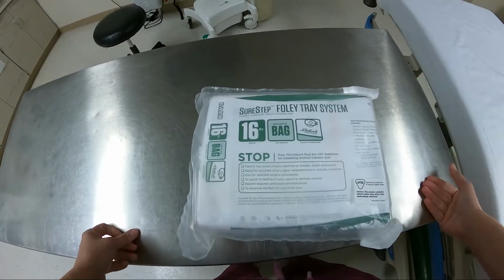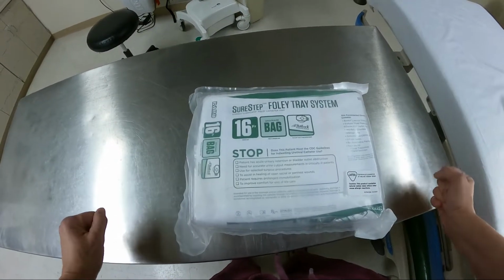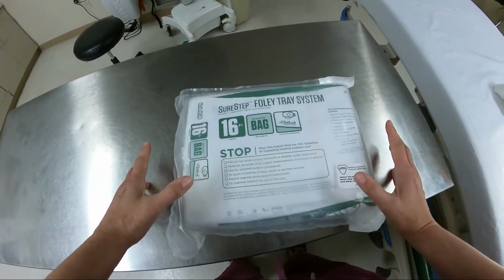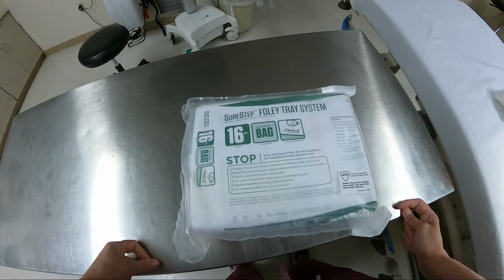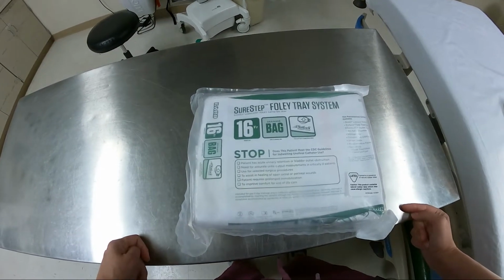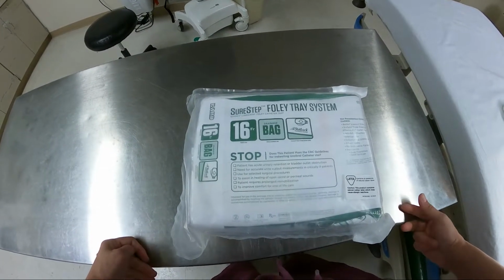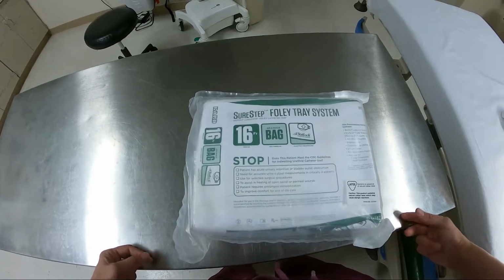So we have a patient here that we have to put a catheter in. We've already verified that that is what the physician wanted. We've discussed it with the patient. Now we need to get ready to put the catheter in. You can put them in with one person. If you have two, that's even better, especially if it's an individual that has comorbidities, is obese, is incontinent, is elderly.